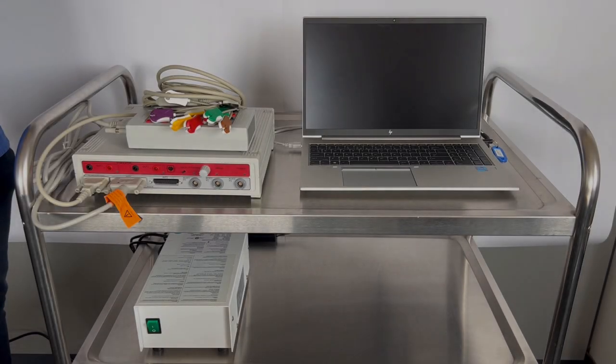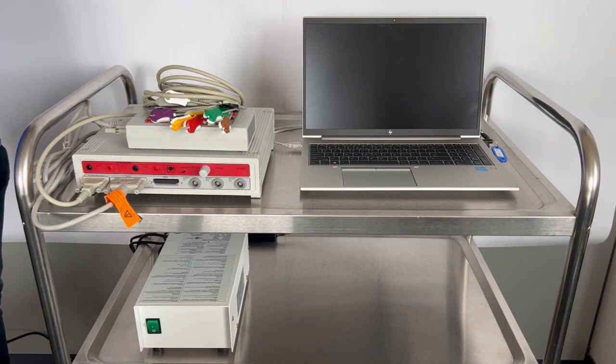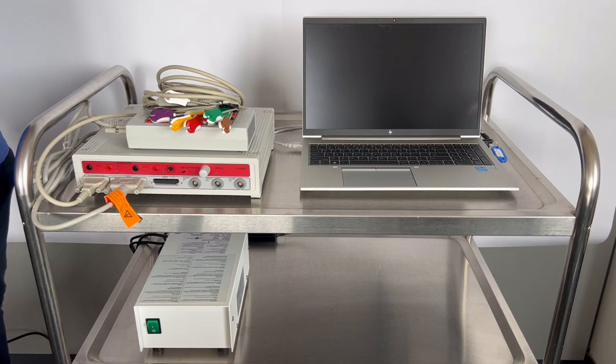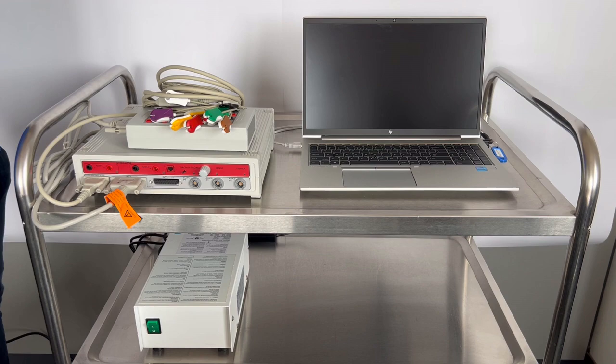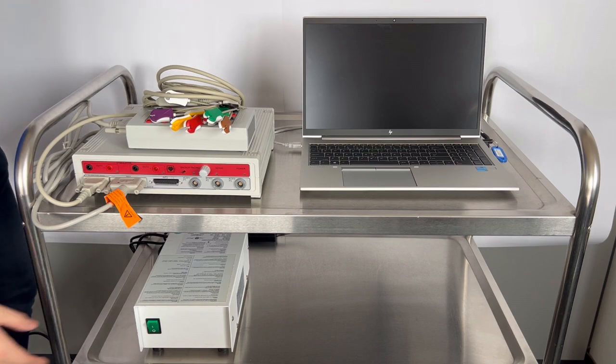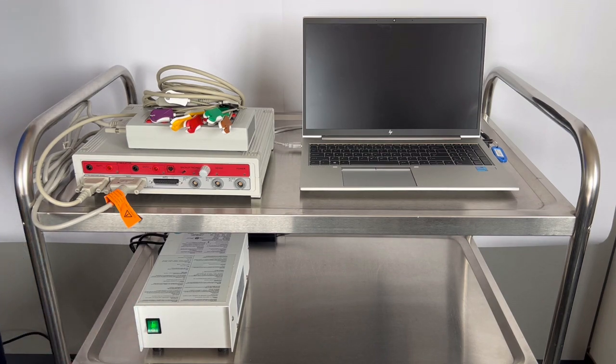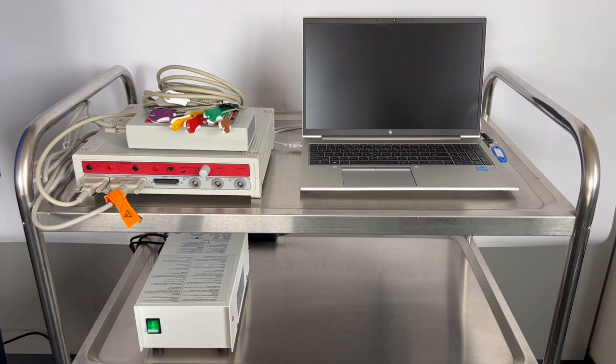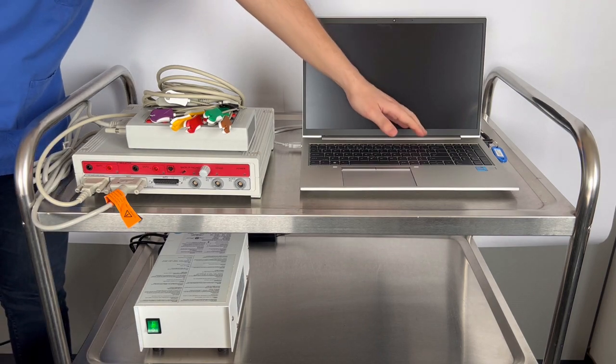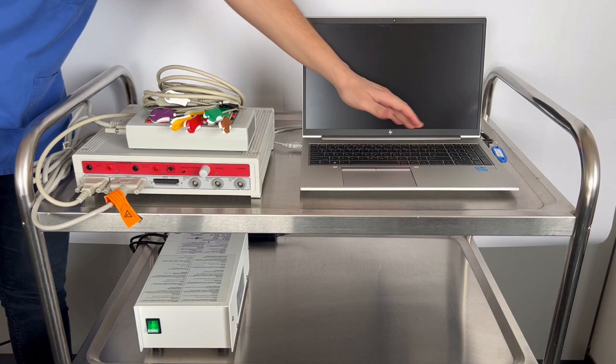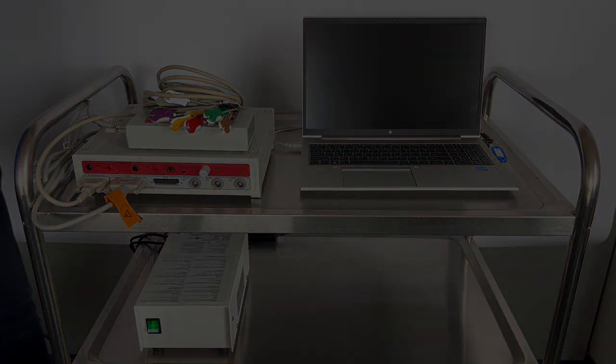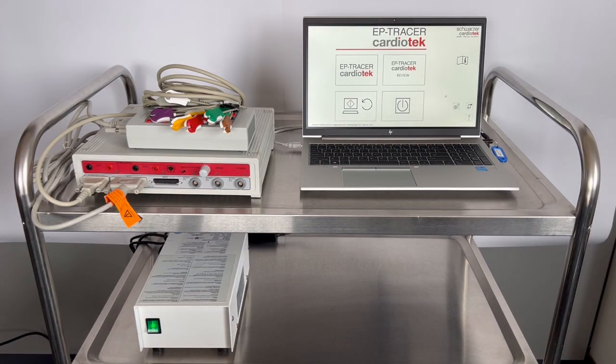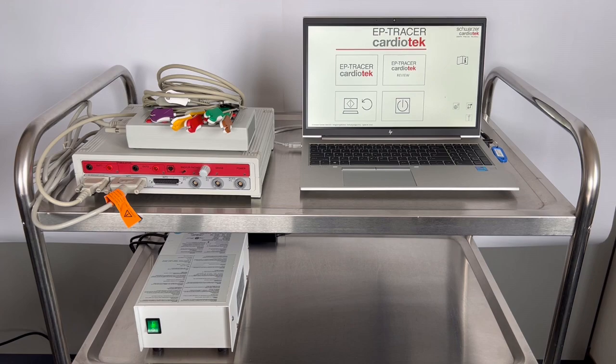With all connections securely established, the next step is to power up the entire system. Simply press the green switch on the transformer to initiate power, automatically activating the amplifier. Following this, press the start button on the laptop, the software will boot up momentarily. And that's it. Now the EP Tracer system is ready for use.